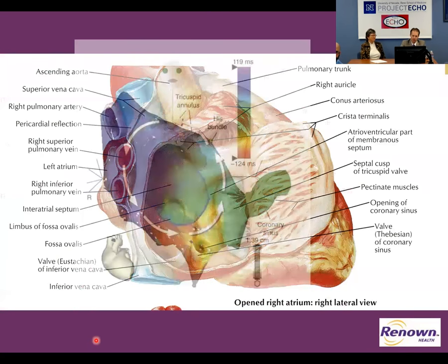I'm going to show a more clear picture in a second, but just to superimpose them, this is an electroanatomical map with an electrophysiology study of atrial flutter. The rhythm goes down the right atrial free wall in typical atrial flutter, up the interatrial septum, and down and up and down. So, macro-reentrant arrhythmia.